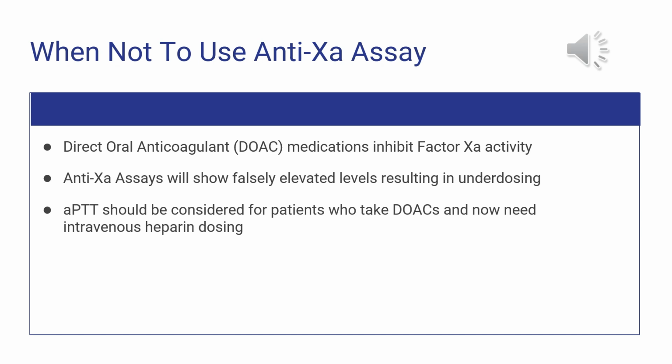So in the instance of a patient who has chronically taken a type of DOAC and now requires intravenous heparin dosing, it might be a better idea to use aPTT for heparin monitoring in order to avoid underdosing.